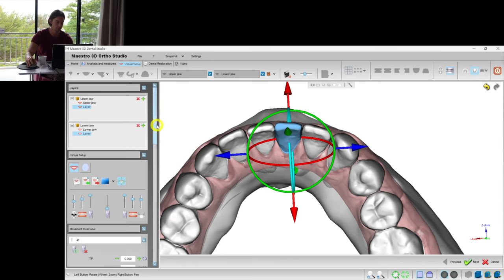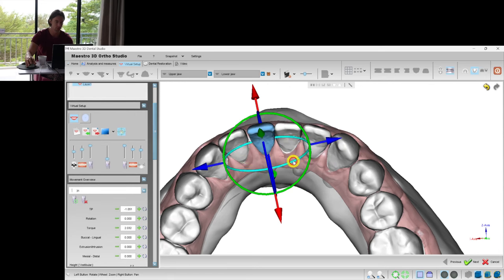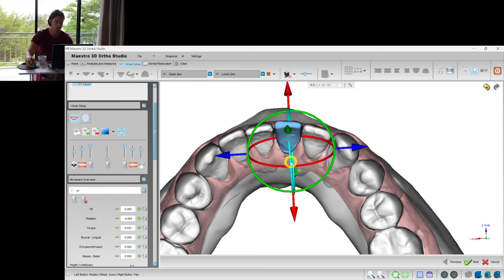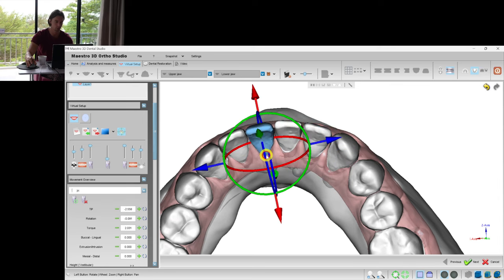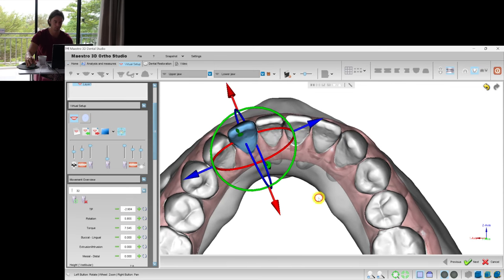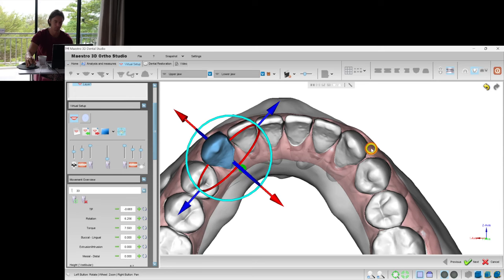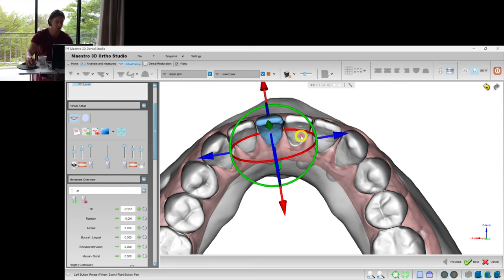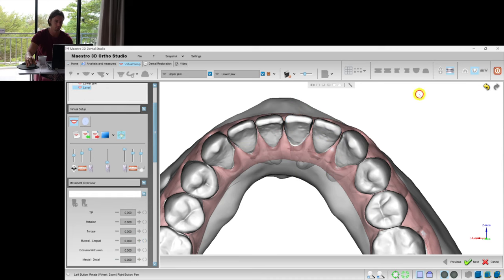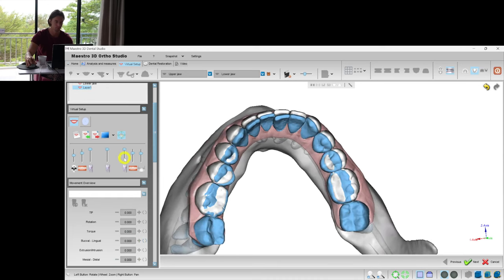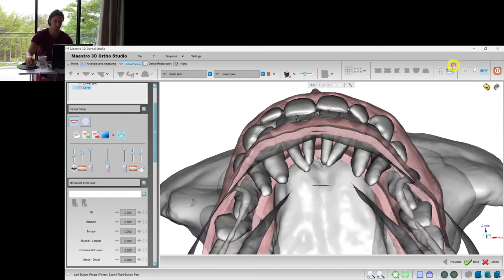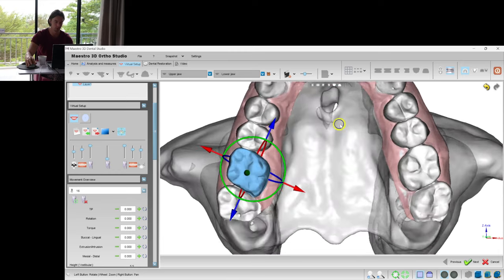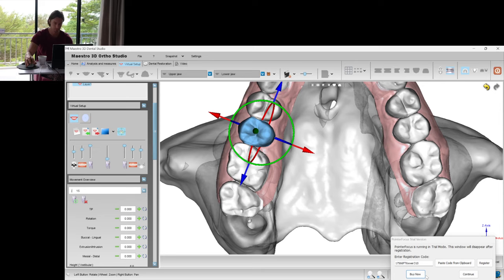There are some exceptions, of course, when we can achieve almost translational movements, for instance distalization with good anchorage reduction combined with power ridges and intrusion. We've done with the lower jaw and now we need to do the same to the upper jaw.